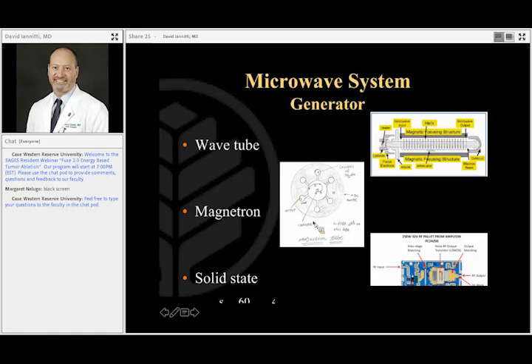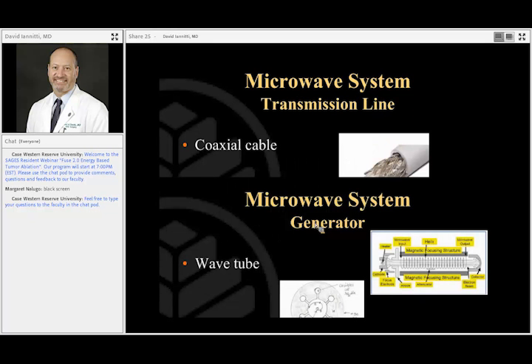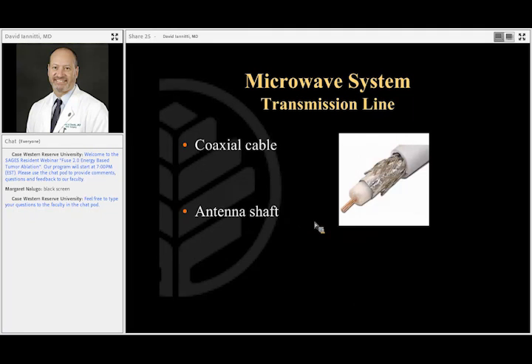Now, all the modern microwave systems used in the United States generate microwaves with solid-state technology, beautiful circuit boards, and then you just amplify that technology to whatever wattage you're trying to push based on your cable impedance and how much power you want at the tip. So once you generate the microwave energy, then you've got to get it from point A to point B, and we use a transmission line. And we use coax cable.